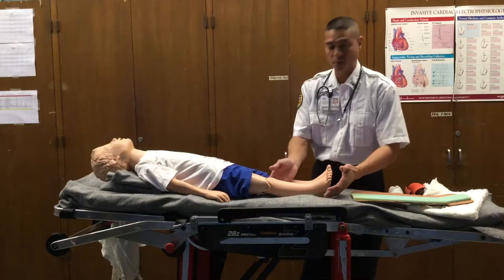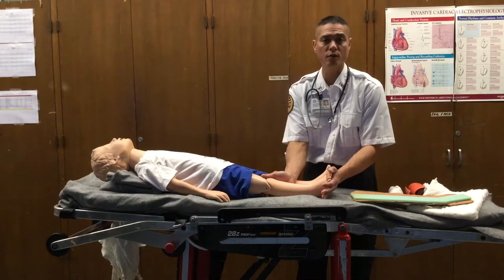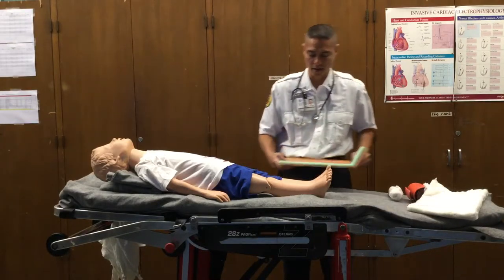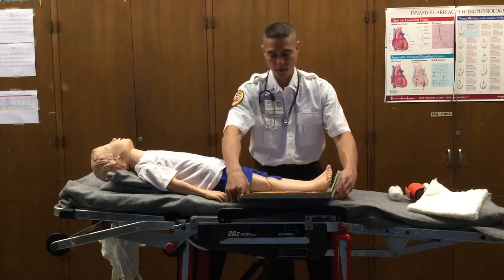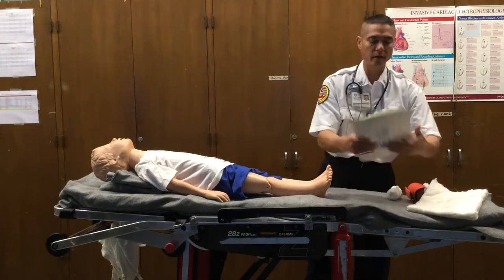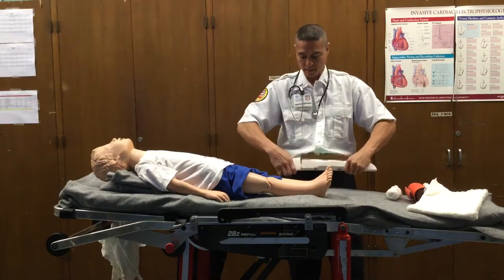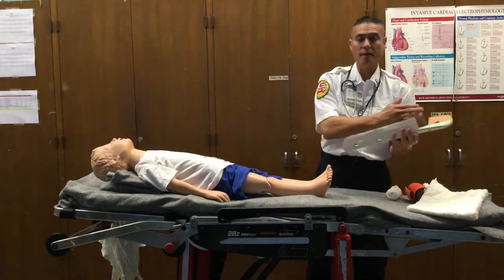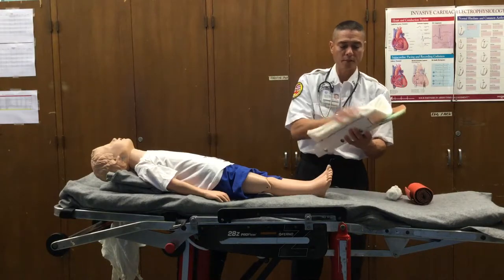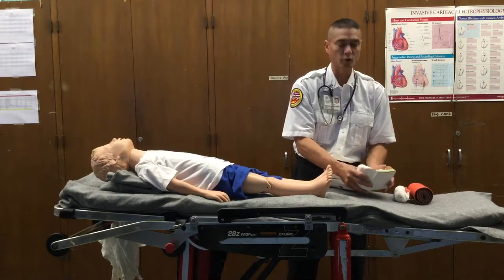Once the extremity is evaluated for PMS — distal parameters, circulation, motor, and sensory — somebody needs to stabilize and make sure that the leg doesn't move anymore. Another provider would immobilize that extremity while you measure out the splint on the unaffected side. This would fit perfectly, covering the ankle and foot as well as immobilizing the joint above — the knee. We would pre-roll these cardboard splints so they mold and conform around the extremity when we wrap it together, adding extra padding to fill voided spaces.